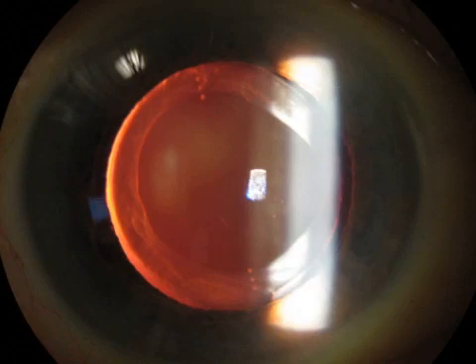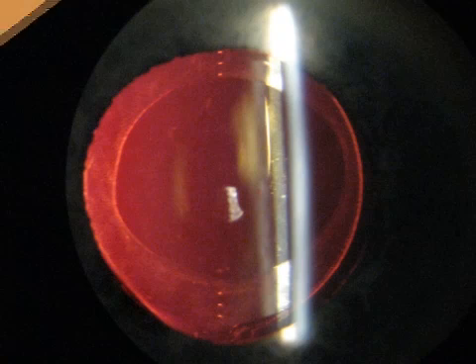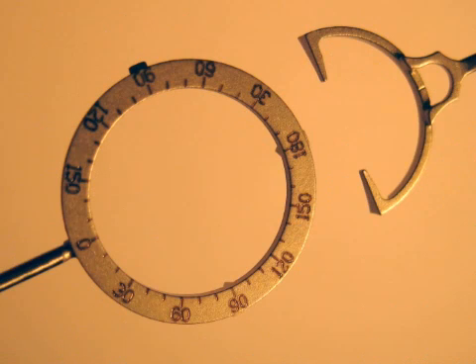This marking system has been used in 15 toric cases with excellent refractive results. The axis alignment has been verified in several cases by comparing the intended axis to a red reflex slit lamp photo of the implanted toric lens. Thanks for your attention. I hope you will find this method helpful in utilizing this very significant advance in lens implant technology.